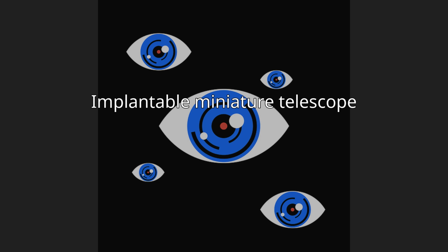2.2x or 2.7x magnification strengths make it possible to see or discern the central vision object of interest while the other eye is used for peripheral vision because the eye that has the implant will have limited peripheral vision. Unlike a telescope, which would be handheld, the implant moves with the eye, which is the main advantage. Patients using the device may, however, still need glasses for optimal vision and for close work. Before surgery, patients should first try out a handheld telescope to see if they would benefit from image enlargement.